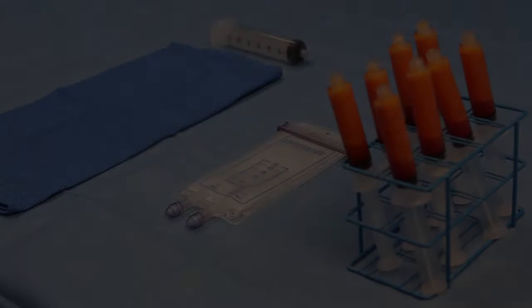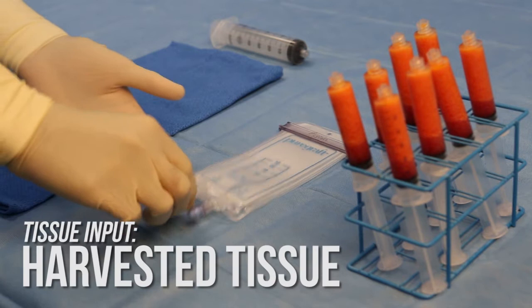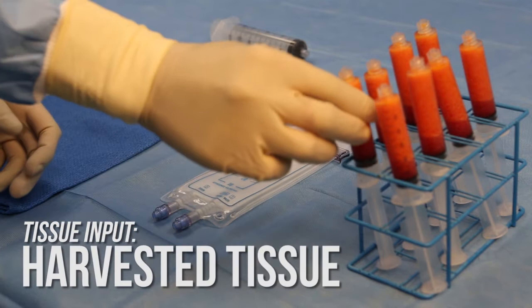Prior to PureGraft processing, tissue must be harvested. As is commonly known, lipoaspirate contains fluids and contaminants, and as with all processing techniques, it is recommended to harvest approximately 50% more tissue than the desired graft volume.